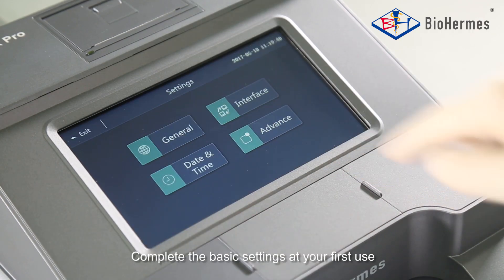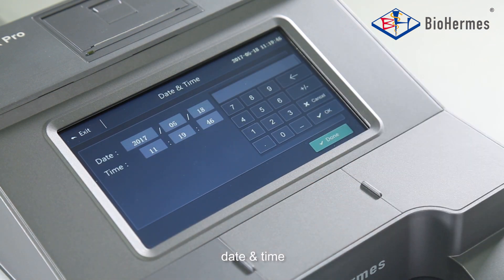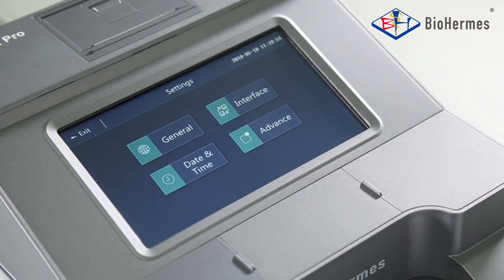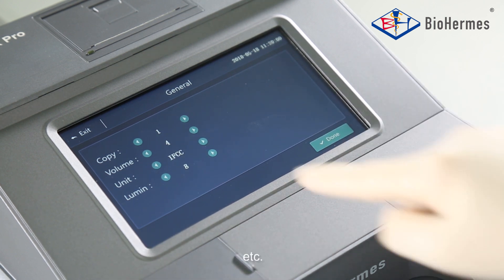Complete the basic settings at your first use, such as date and time, print copies, volume, unit, etc.